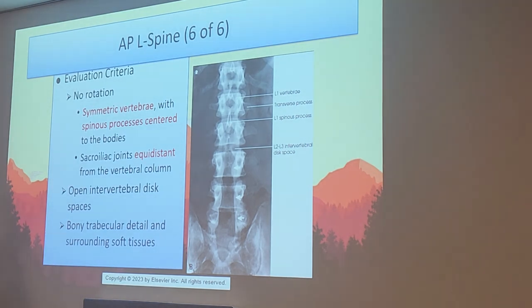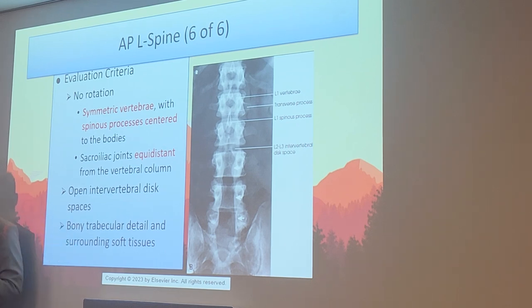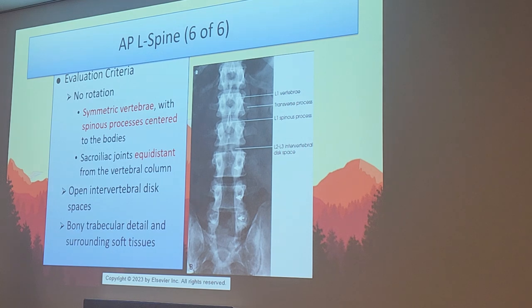Of course, what else do you want to see? Nice, beautiful, open intervertebral disc spaces, like we see right here. And then your high detail, which what makes the biggest difference on your detail is not only the technique, but once again, the tight collimation. When you leave it wide open, like some of these techs do, it's going to degrade that overall quality, defeating the purpose of what we want to see on that L-spine. So that's your evaluation criteria of the AP L-spine.